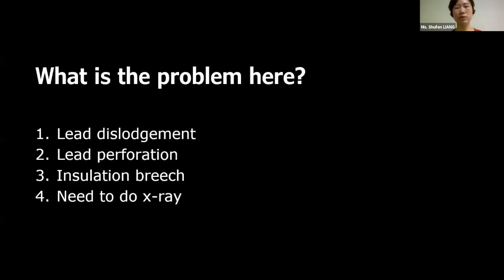Okay, so what do you think is the problem here? Could there be a lead dislodgement, lead perforation, or insulation breach, or do you think there's a need to do an X-ray to further help you in this? I think we gave everyone 30 minutes to have a selection.